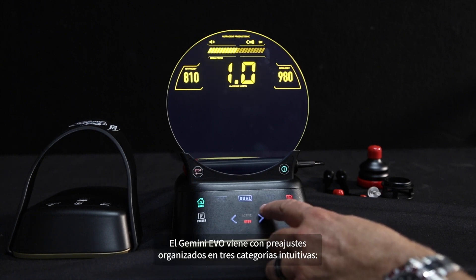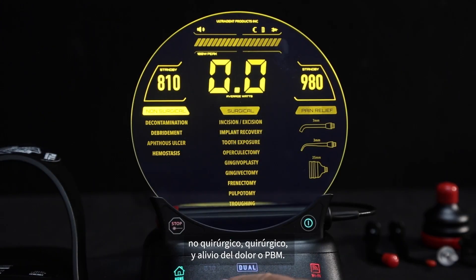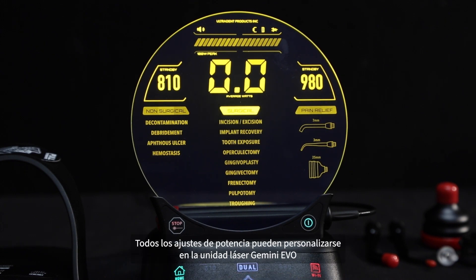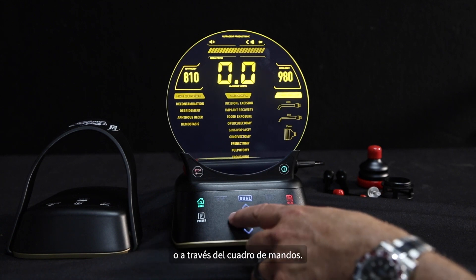The Gemini Evo comes with presets organized into three intuitive categories: non-surgical, surgical, and pain relief or PBM. All power settings can be customized on the Gemini Evo laser unit or via the dashboard.